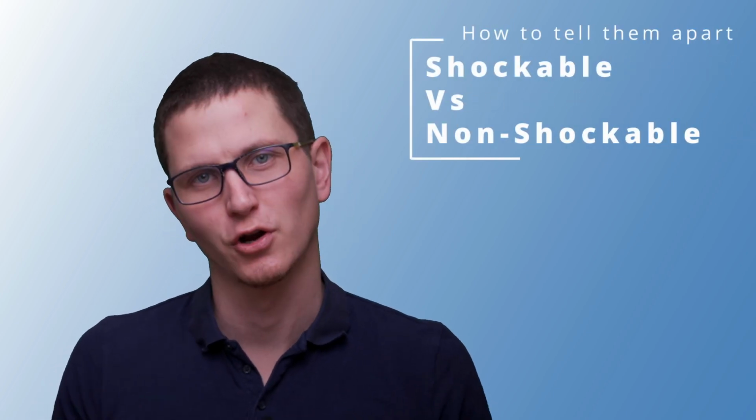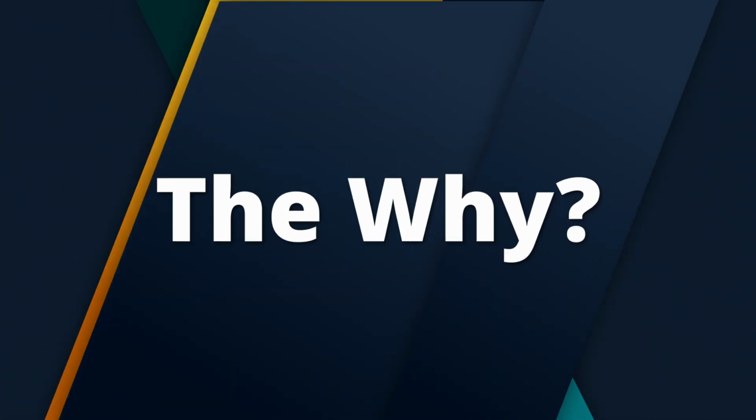Alrighty, so welcome back. Today we're going to be tackling shockable versus non-shockable rhythms. This is a really fundamental aspect of cardiac arrest management, especially if you are heading towards an advanced level, to understand the differences. I've picked up that this is a pretty good breakdown of knowing which rhythms are what and the why, right? I'd always recommend that you think about the why of whatever we're doing. So what are the shockable rhythms?